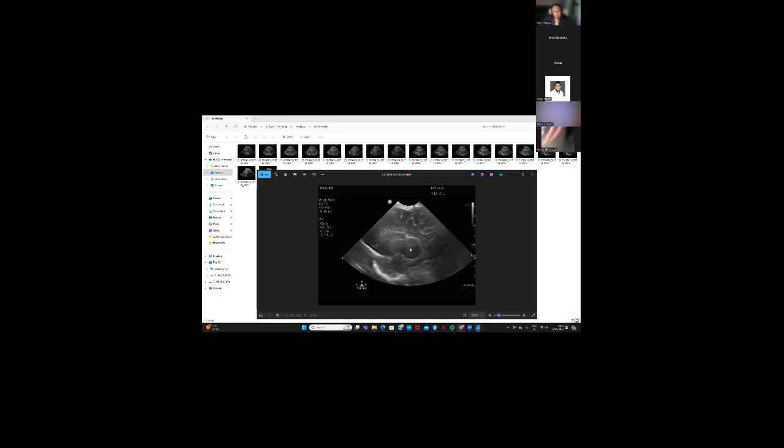We do see some sulci at the top. Is his sodium low? Can I just ask? Sodium, yes, it is. Both hypocalcemic and hyponatremic, yep, both. This is where we can see, a little posteriorly, the choroid. Yep, a little bit. Well done. Then these are the most extreme sagittal views on the left side.